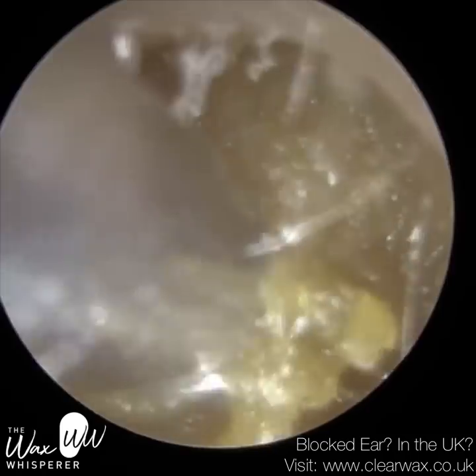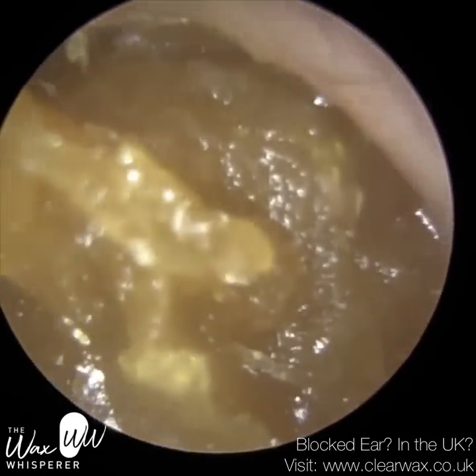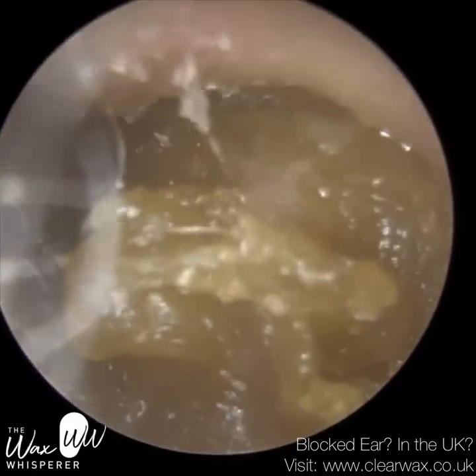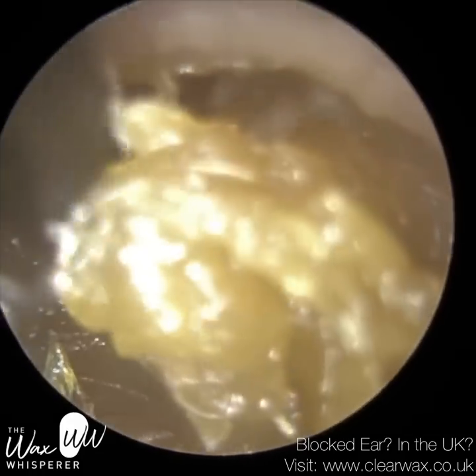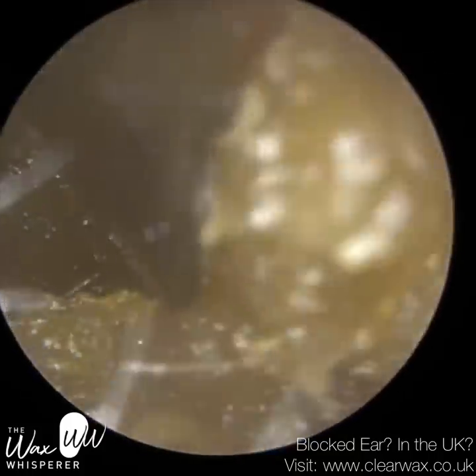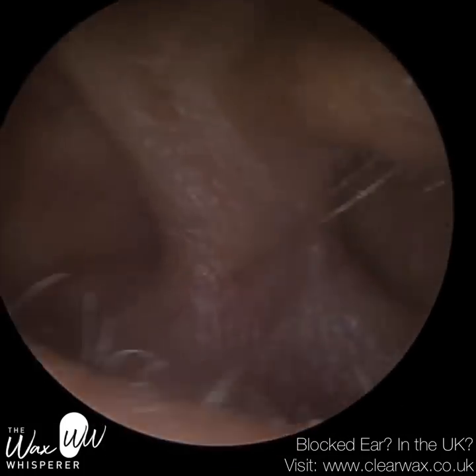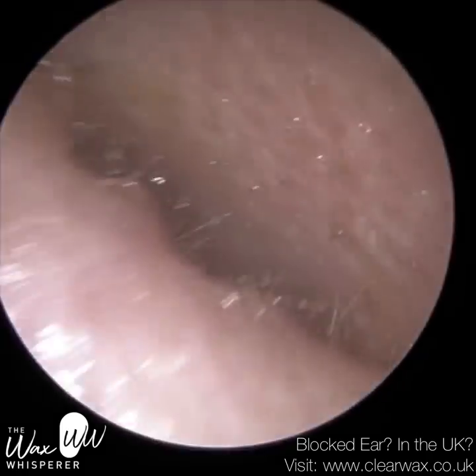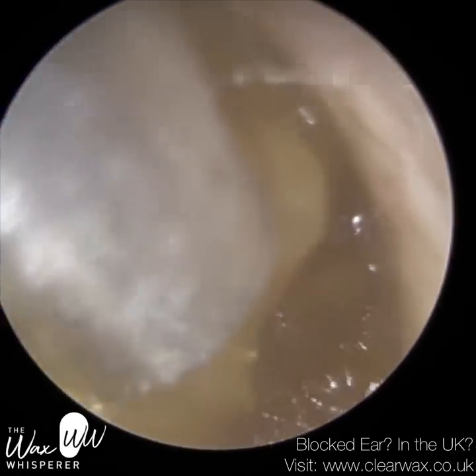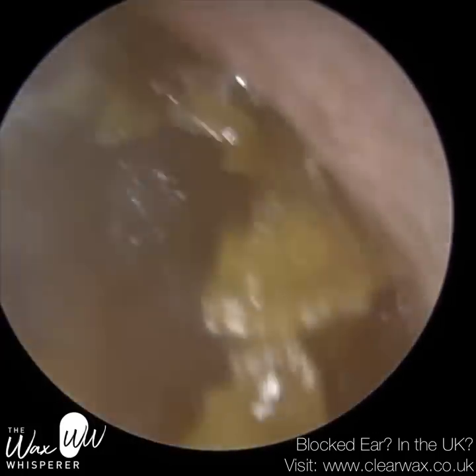There's actually a lot of dead skin here. This is a very difficult consistency of wax and skin to remove because it keeps blocking the tube — you'll see me constantly coming in and out of the ear. I tried using a Jobson horn to scoop this out, but the consistency is too glutinous and too soft. Although I got a little bit out, it began to spread this soft, mushy wax along the floor of the ear canal, so I just had to resort back to suction. I've put loads of drops into the ear.